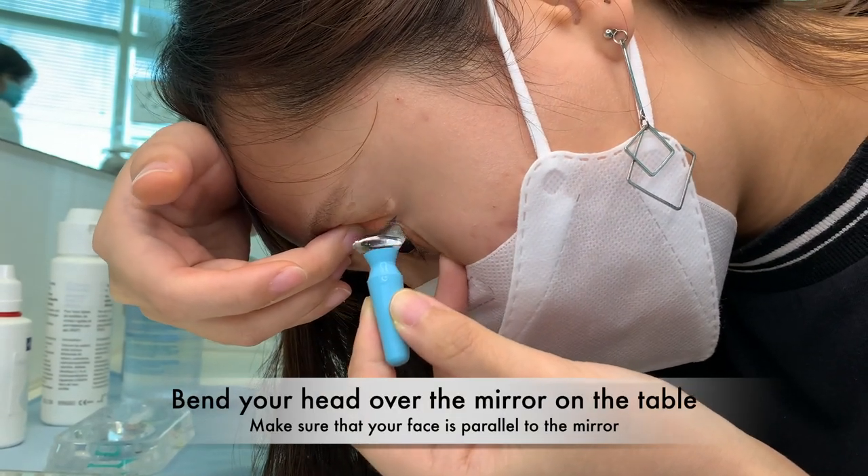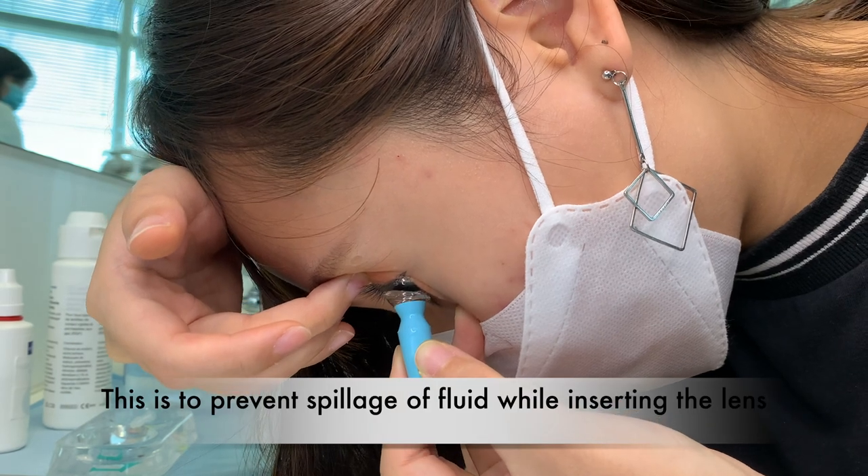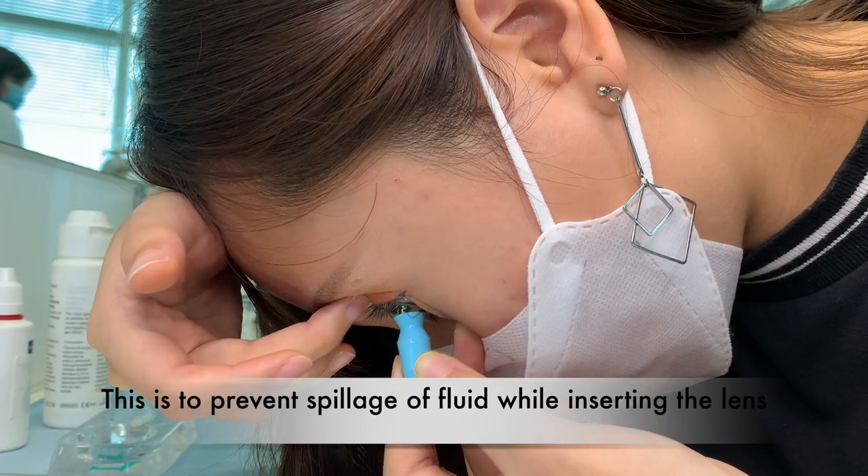Bend your head over the mirror on the table and make sure that your face is parallel to it. This is to prevent spillage of fluid while inserting the lens.